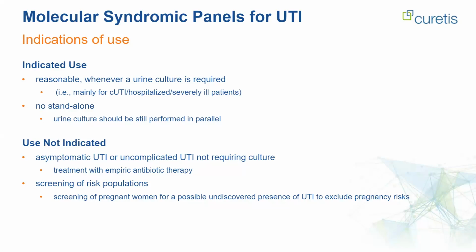On the other side, use is not indicated whenever culture is also not indicated. That is for asymptomatic UTI or for uncomplicated UTIs for which an empiric treatment is already considered sufficient. It would also not be useful to screen healthy populations for risk factors, for example, screening pregnant women for a possible undiscovered presence of UTI to exclude pregnancy risks.